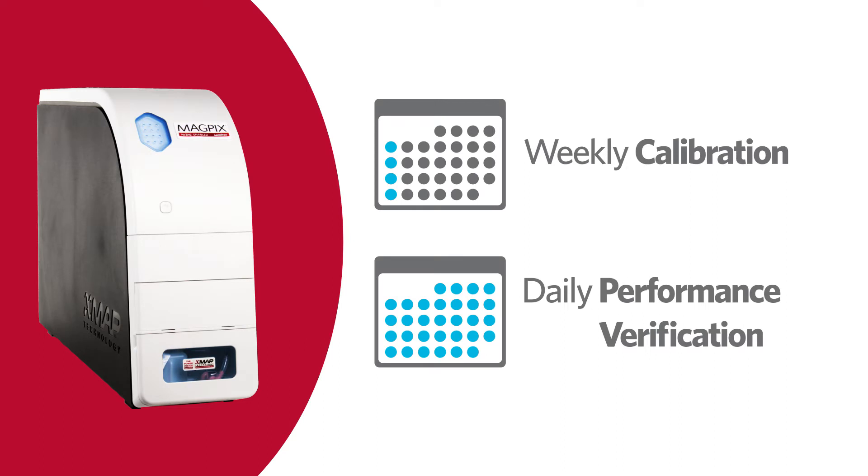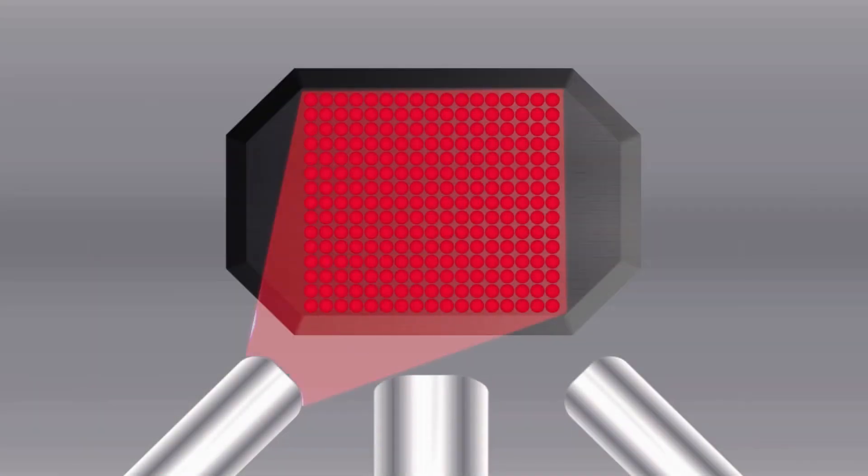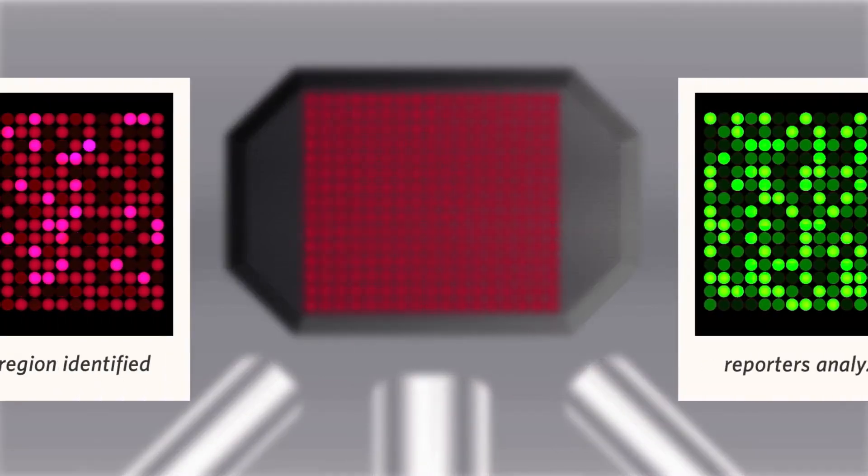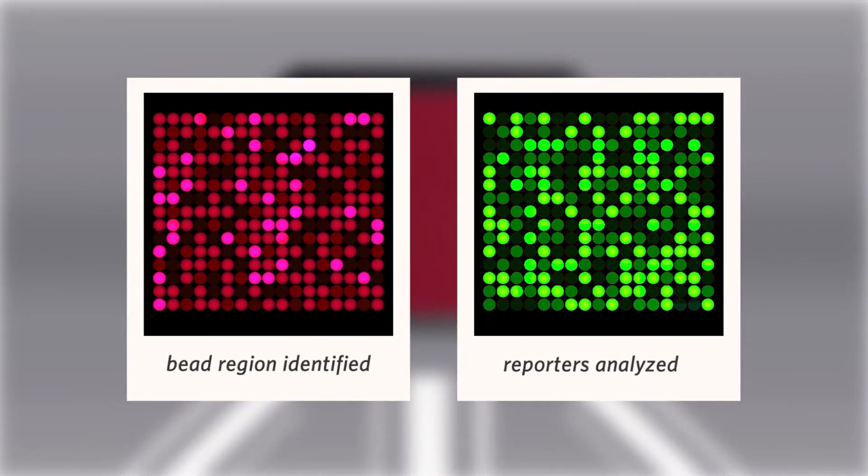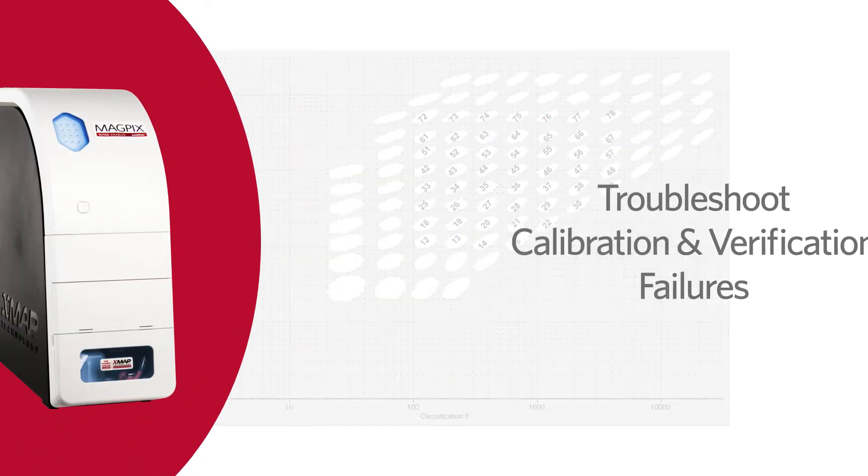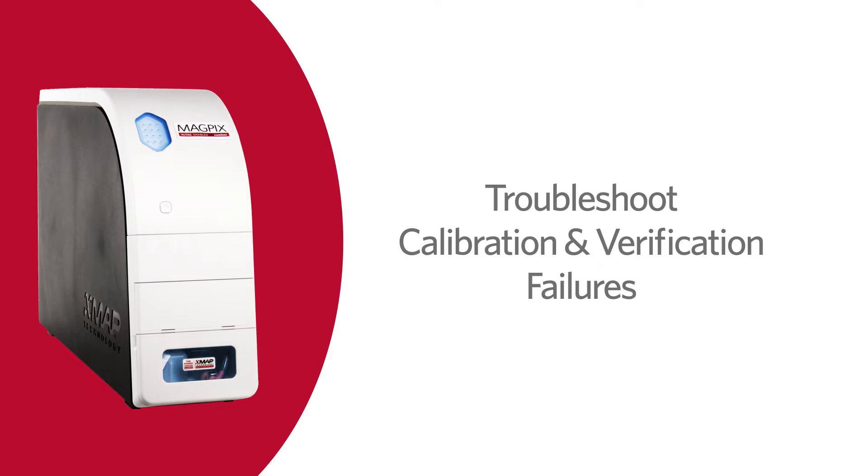Running a weekly calibration and daily performance verification on the MAGPIX instrument is essential for maintaining instrument performance. Calibration and performance verification checks the accuracy of your MAGPIX results by ensuring the MAGPIX instrument is placing beads into the correct regions on the beadmap. If the calibration and performance verification fails, it is important to troubleshoot the failure in order to get the MAGPIX instrument working correctly again.